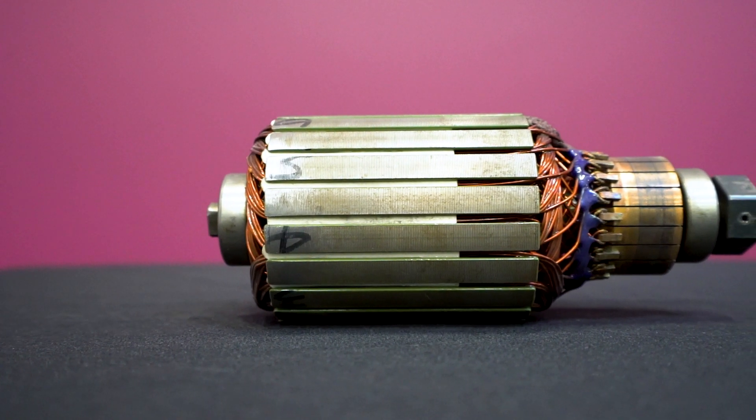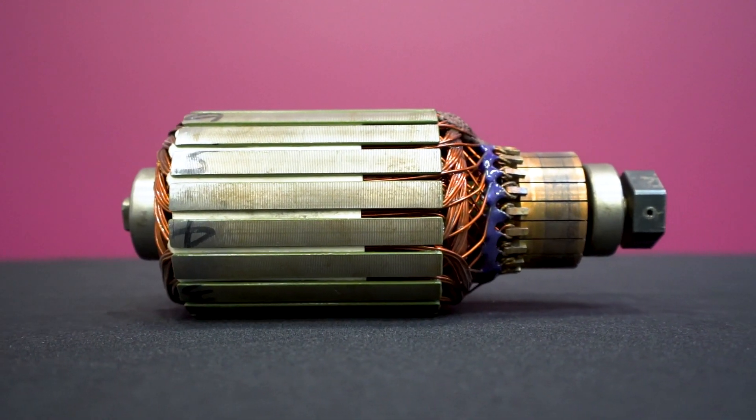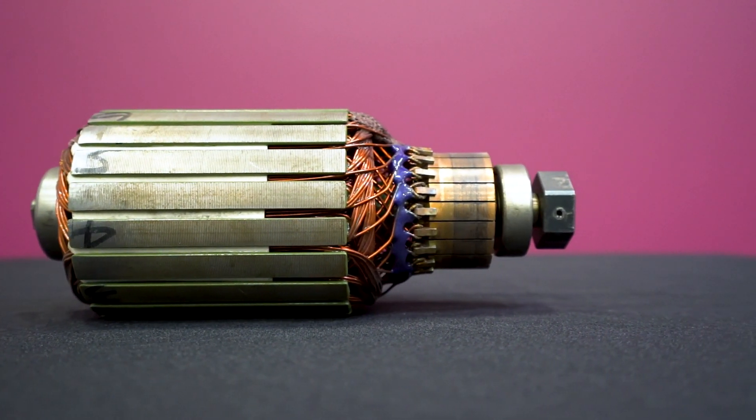The armature is the moving part of the PMDC motor which consists of the windings, commutator, and the output shaft.